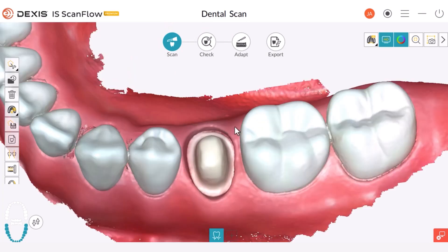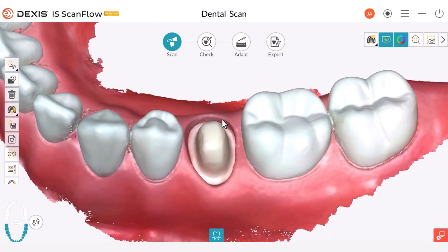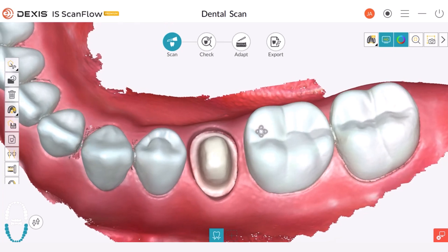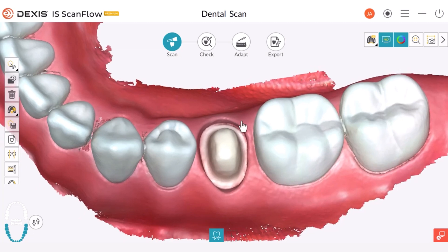Here the tissue and the prep are nicely separated. However, as you continue scanning the other side of the prep, saliva or tissue might infringe on the other side of the margin. This is where the lock tool comes into play. You can use the lock tool to prevent those areas from being scanned and be confident that you will have a nice, clean scan at the end.